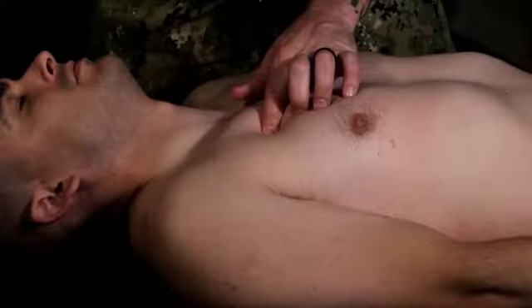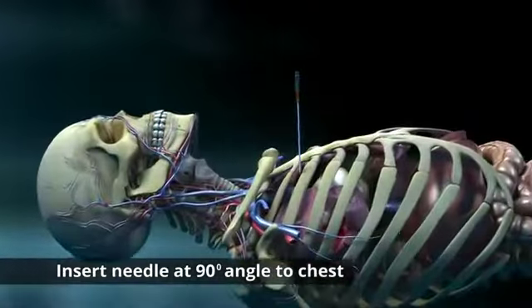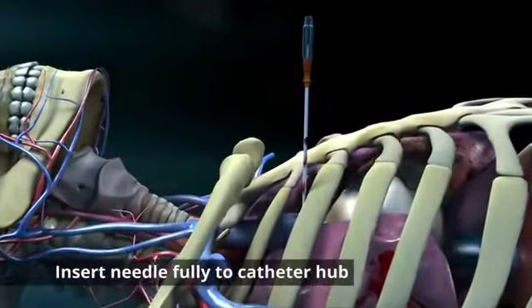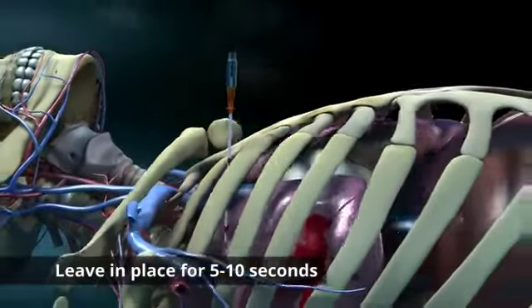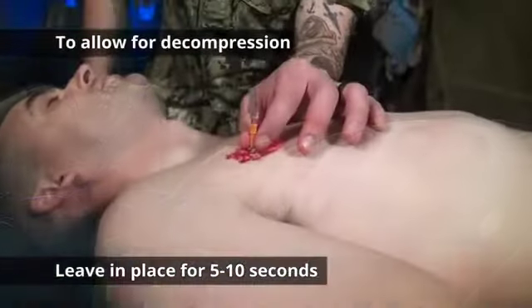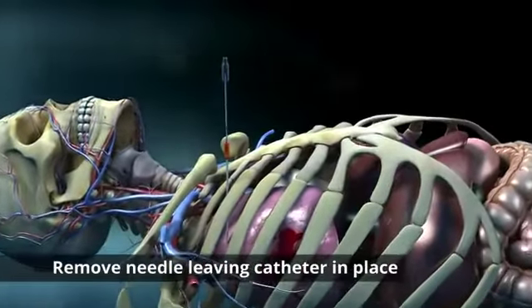I have my site identified, and I'm just going to insert this at a 90-degree angle perpendicular to the patient's chest. Insert the needle and catheter fully to the catheter hub and leave in place for 5 to 10 seconds to allow complete decompression to occur. After the decompression has been performed, remove the needle, leaving the catheter in place.